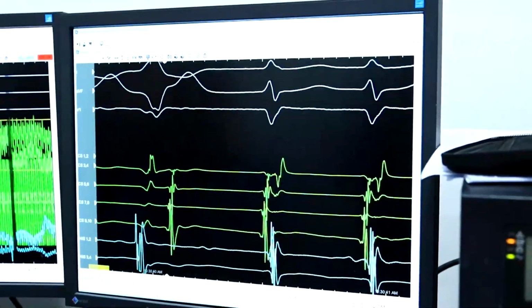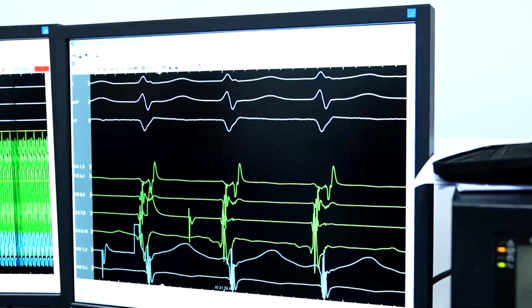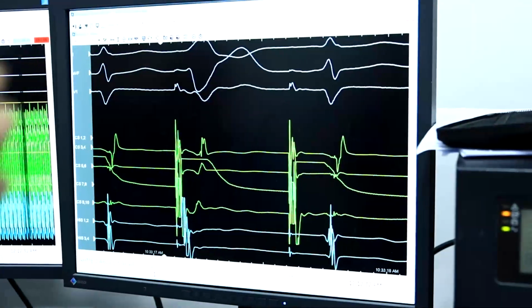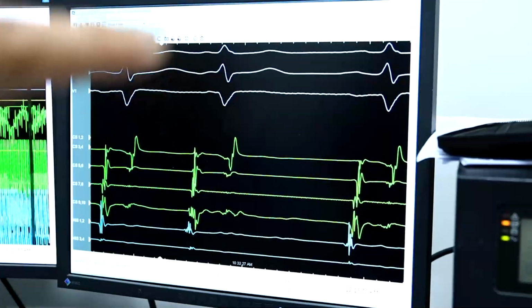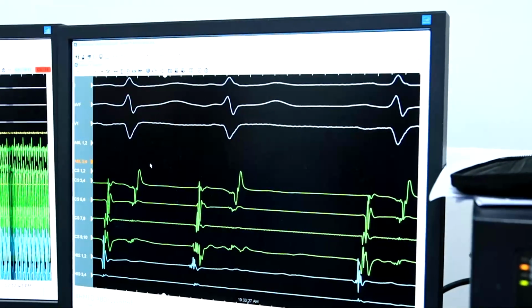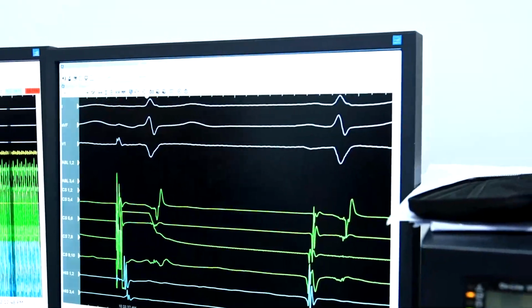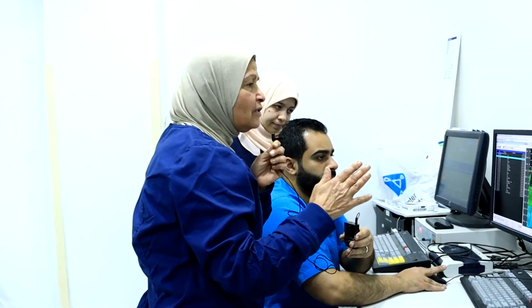But we kept inducing the tachycardia with the earliest atrial electrogram recorded at the distal CS. The distal CS was not actually in the left lateral position. It was in a vein in the posterolateral position of the mitral annulus. So we finished with the easiest one, and we did not demonstrate jump and echo, but the tachycardia kept going. So we ablated the slow pathway.